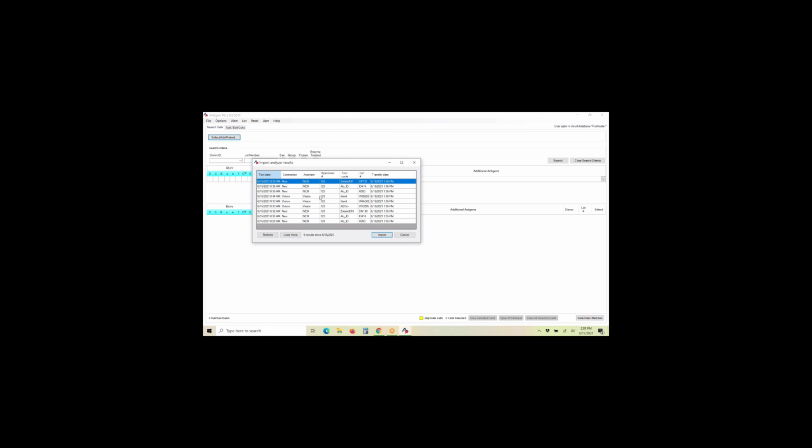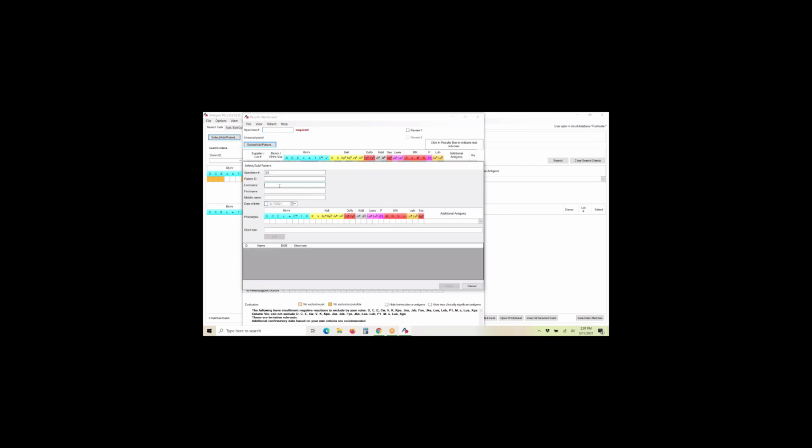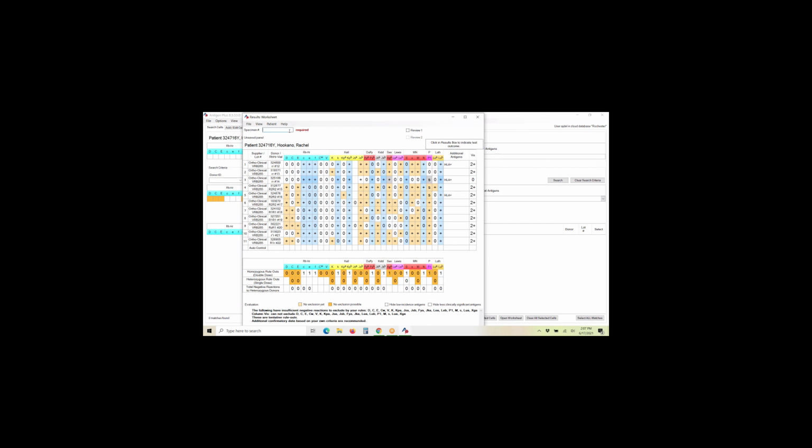Now we'll go ahead and close this. There we are. Select our patient. Sample number in there.